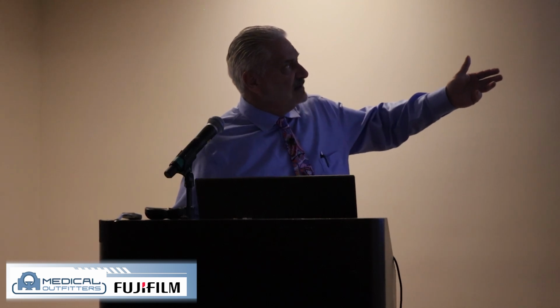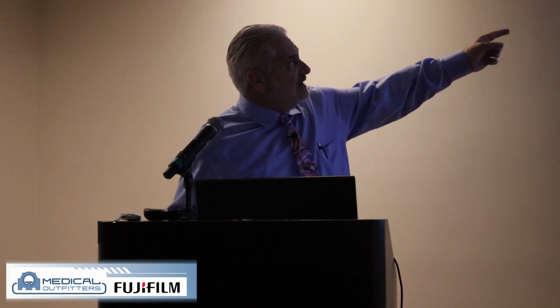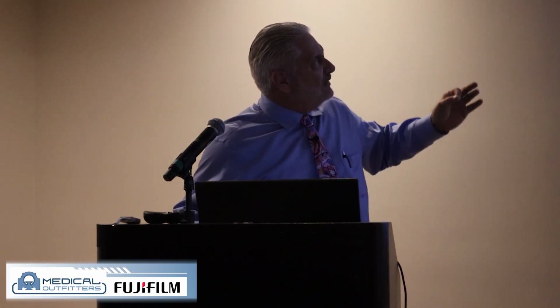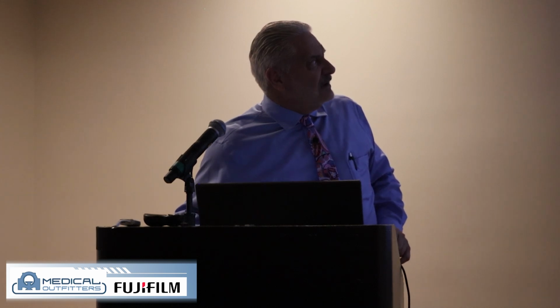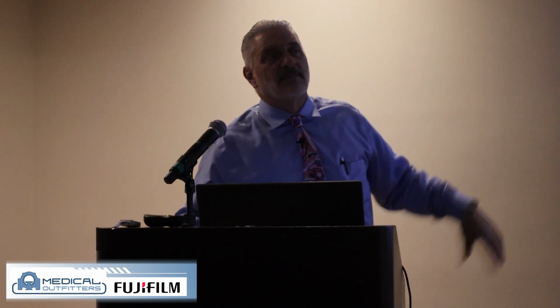So I can come up to the top of this and I can rotate this around. One of the reasons I would do that is to see, is it visible? Is this one part, in that proximal portion of the RCA, does it have a little bit of plaque there? As I rotate it around, it looks like the barrel is a little bit narrowed right there. It also gives me the ability to see the atherosclerotic disease, but at the same time, I can see all of the bifurcations as they come off of that vessel.